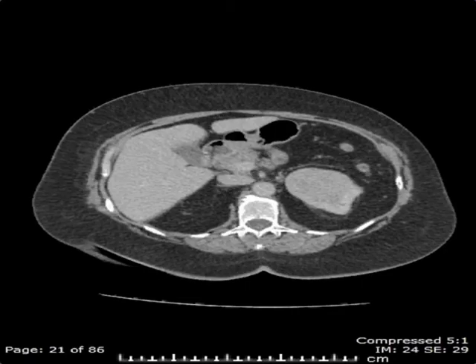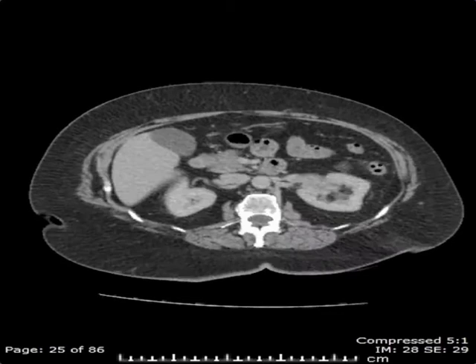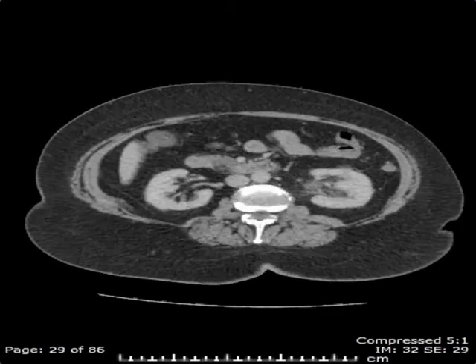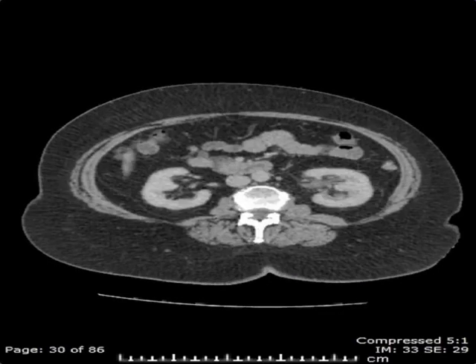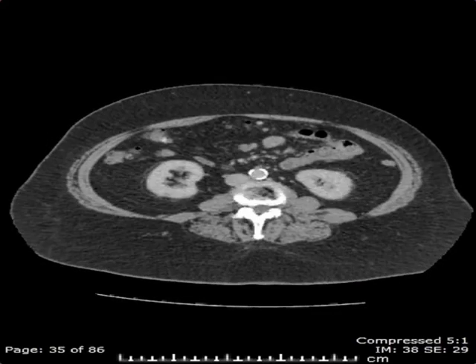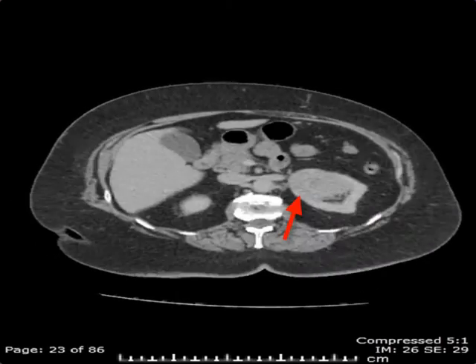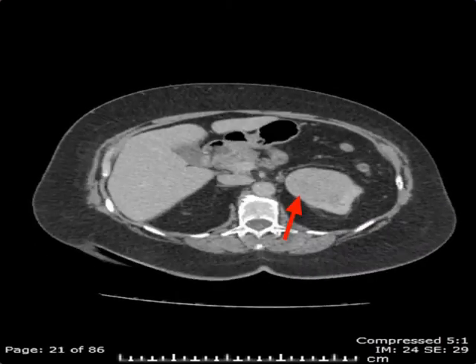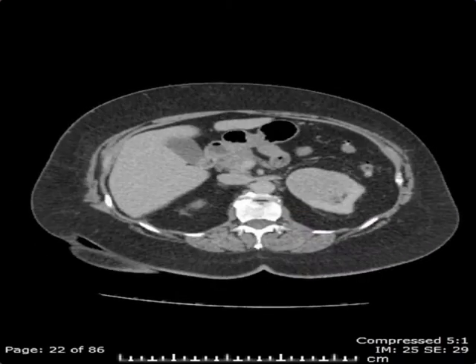As you scroll inferiorly, we can see that there is an exophytic, predominantly solid mass arising from the upper pole of the left kidney, compatible with a renal cell neoplasm.